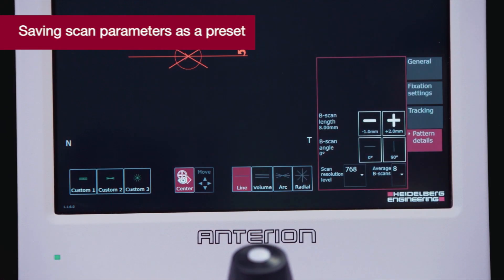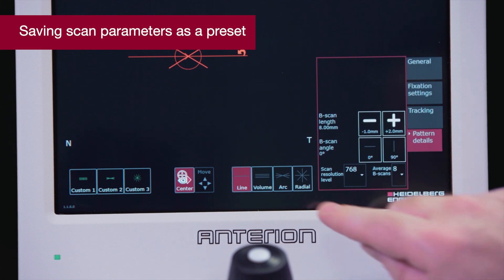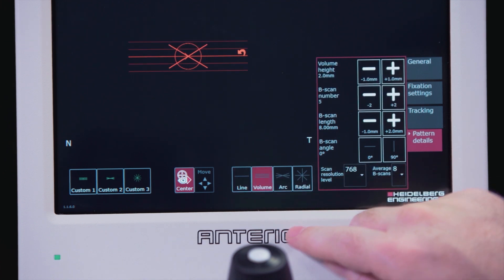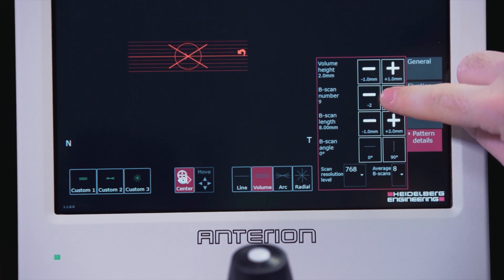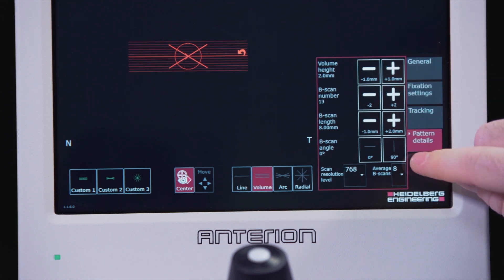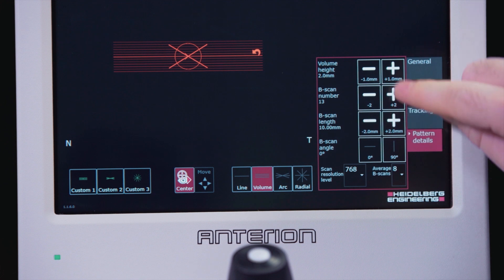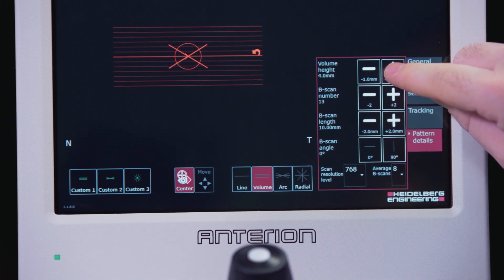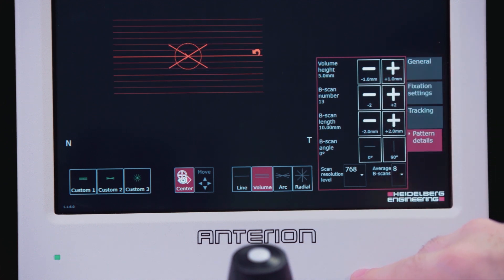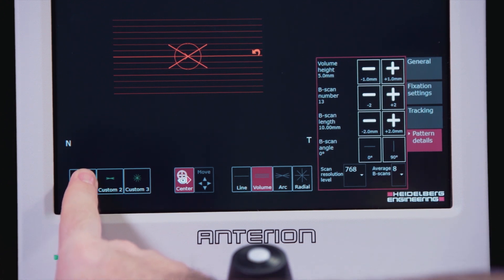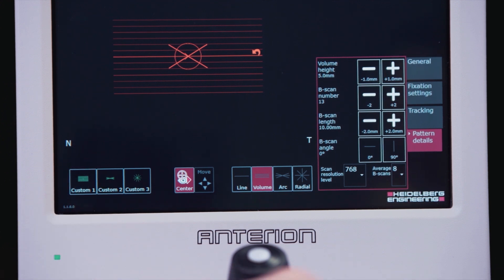For volume patterns on the pattern details tab, we can also adjust the height and number of B scans. You can save up to three personalized scan patterns by holding down the custom buttons one, two, or three until the message pattern preset saved is displayed. The symbol of the scan is saved on the preset button.